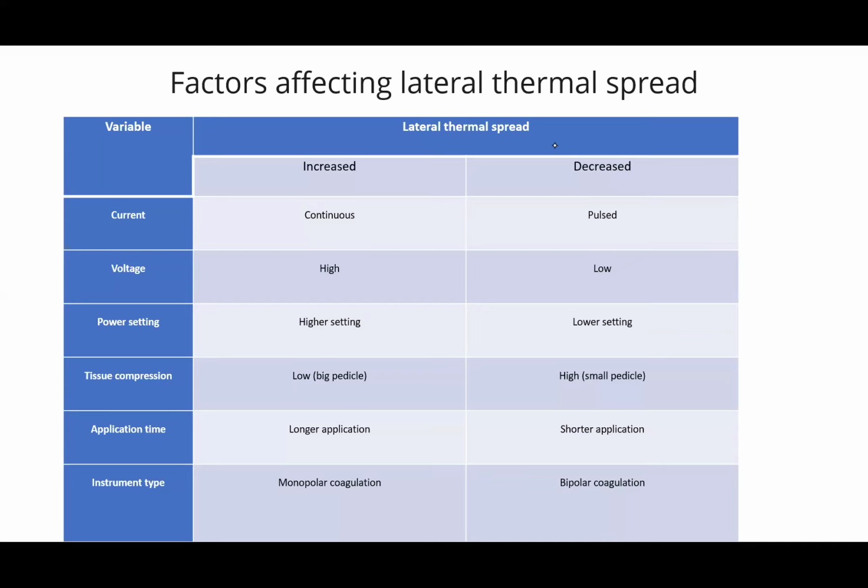Okay, now these are the variables affecting lateral thermal spread. For current, continuous current increases the lateral spread, but when you pulse, it decreases.